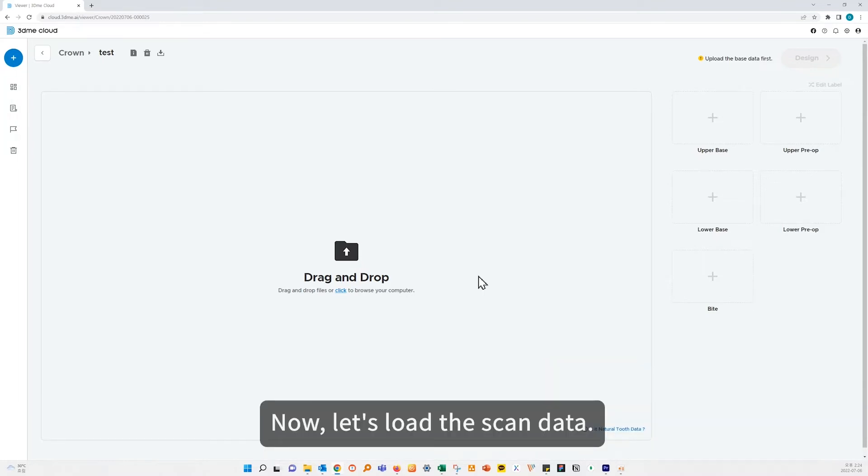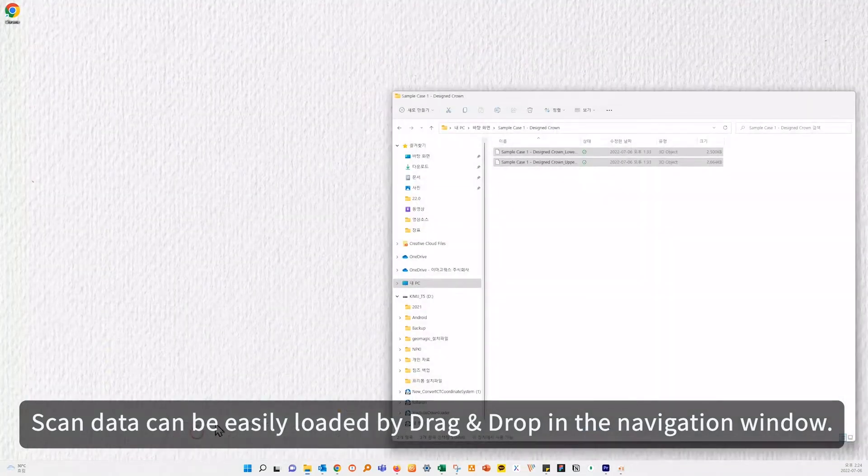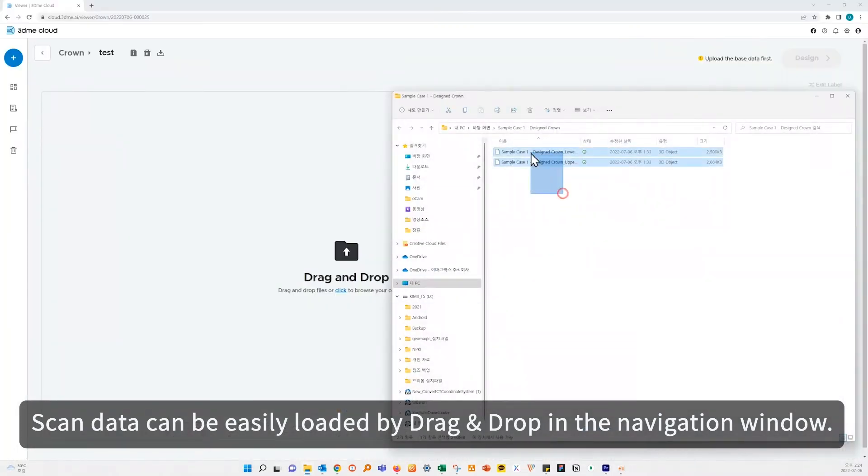Now let's load the scan data. Scan data can be easily loaded by drag and drop in the navigation window.